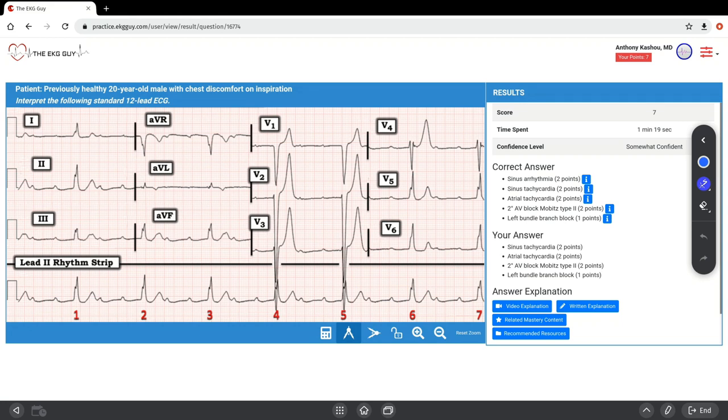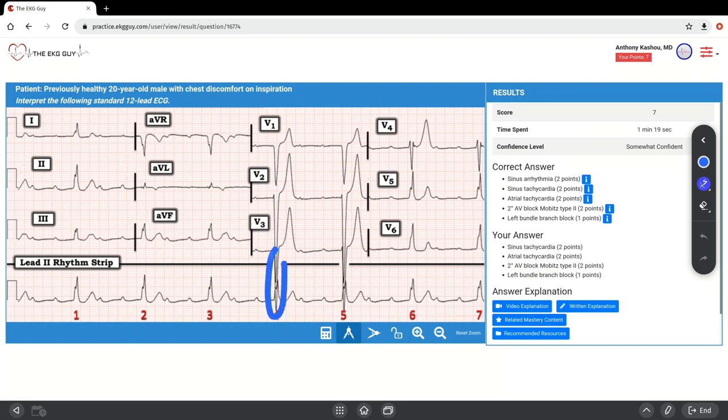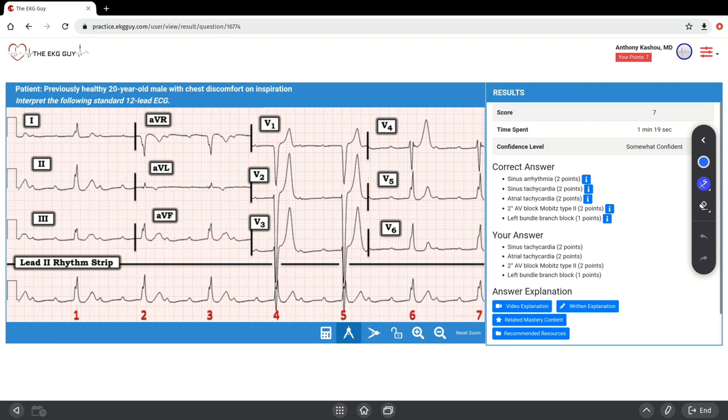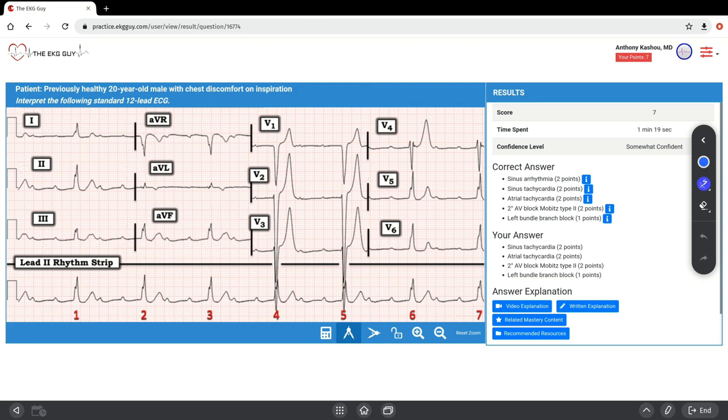we see QS complexes in lead V1. You see that. You also see RS complexes, a wide S wave in V2 and V3. See that here, merging into the rhythm strip below. You also have broad monophasic R waves in the lateral leads V5, V6, and lead 1. You can see some notching there in V6 and lead 1. There's no Q wave presence in the lateral leads. Taken together, these findings associated with the prolonged QRS interval are consistent with complete left bundle branch block.